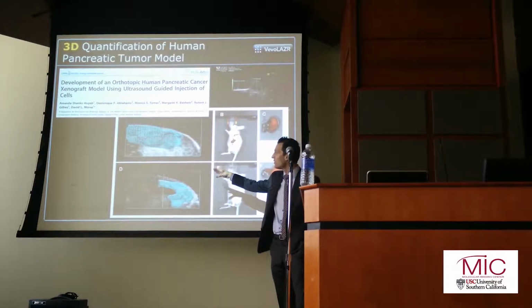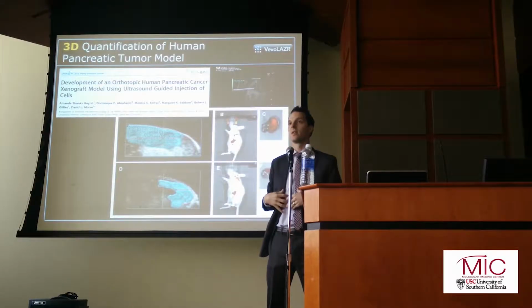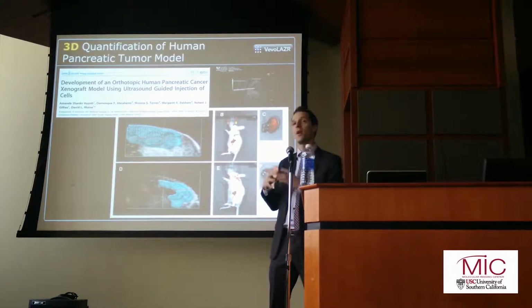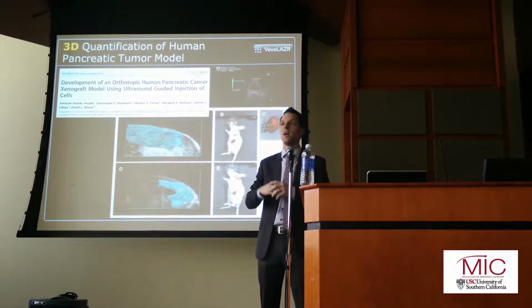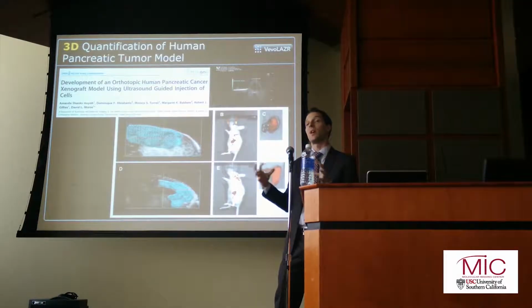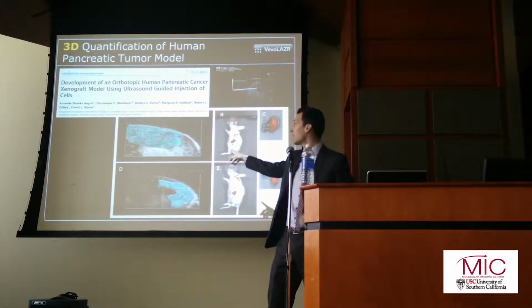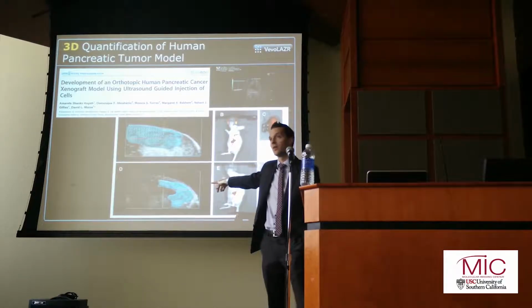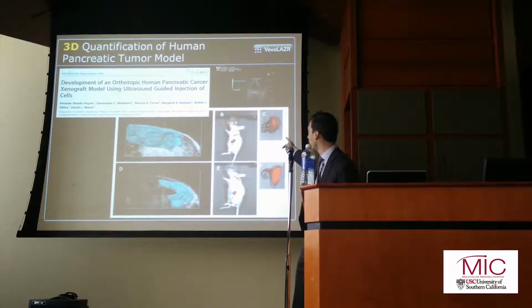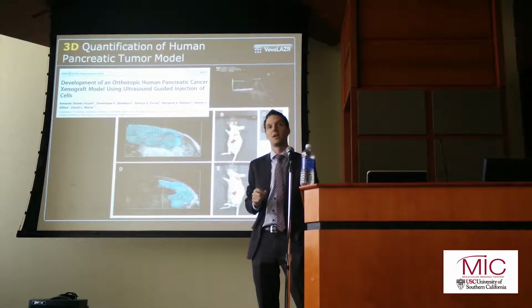As soon as we go in vivo, at depth in the animal, into the pancreas, we can now outline the morphology of these actual tumors because they look different than the surrounding pancreatic tissue. You can tell the morphology, the size, volumes of the tumors, and really tell these are quite different tumors, as you can see by the 3D renderings here generated from our system, but it would be difficult to tell that just if you're looking at a simple optical system or even palpation.